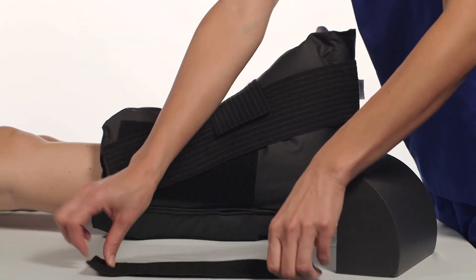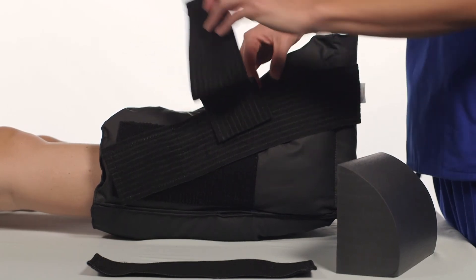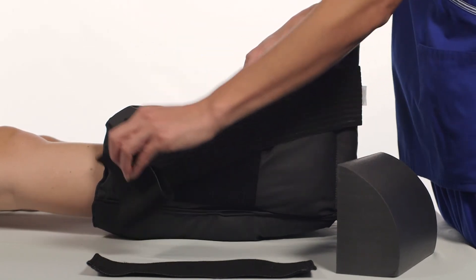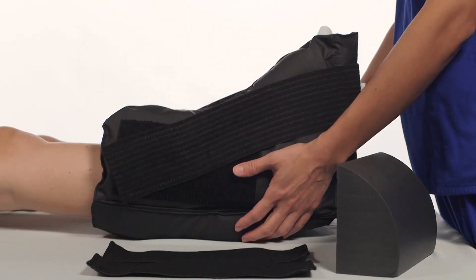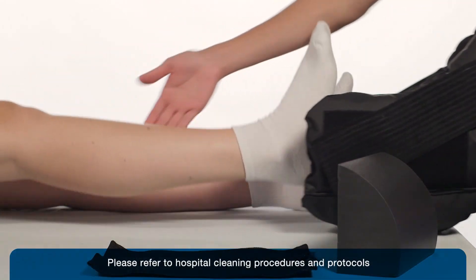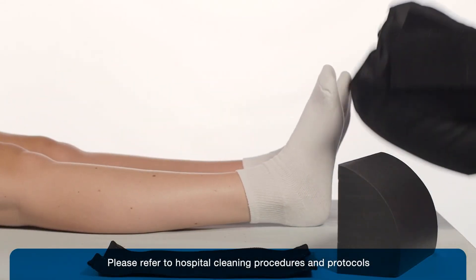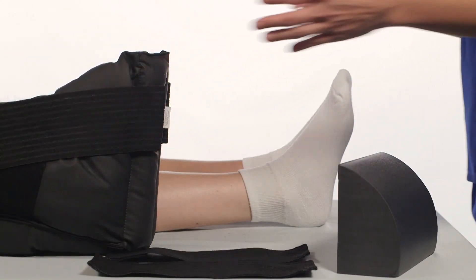Rest the straps on either side of the boot. Gently remove the boot. The boot can be cleaned with a damp cloth and mild detergent or disinfected. Allow the boot to dry before reapplying.